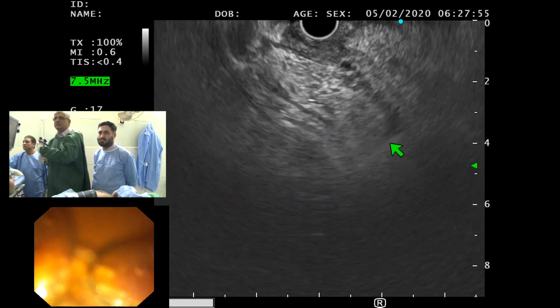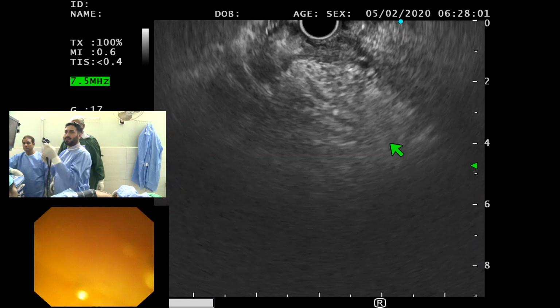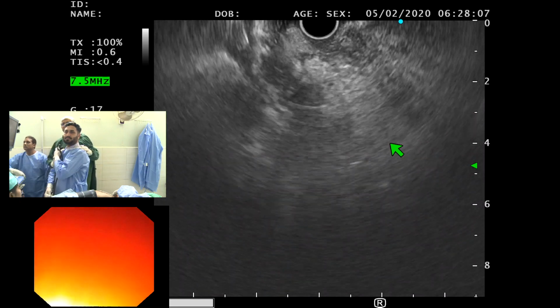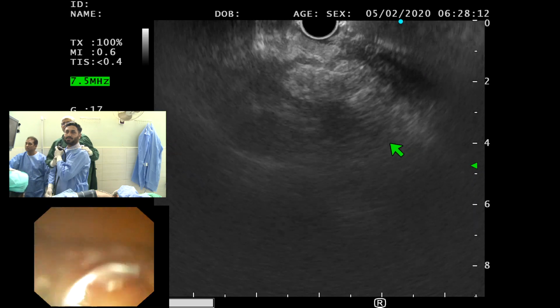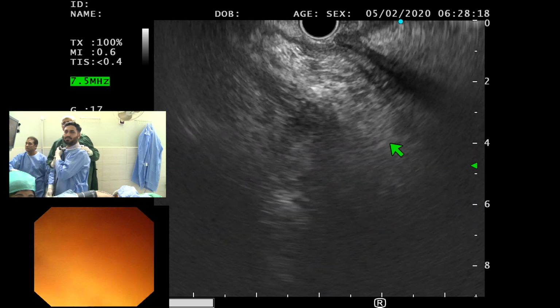I want you to just feel this. Leave this scope like this. You can now hold the scope. Now you will rotate. Gently rotate this way. Gently rotate. You've got the CBD, right? Tip up. Yeah, I think it's very important to keep your tip up.